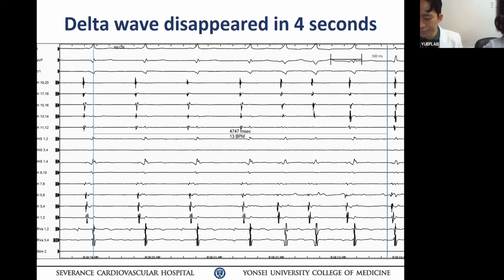I didn't see any Mahaim potential. You're not going to see that, the area is too low. I don't think it is, but the ablation responses could be bystander, but I cannot explain why the pre-excitation got bigger during the burn.